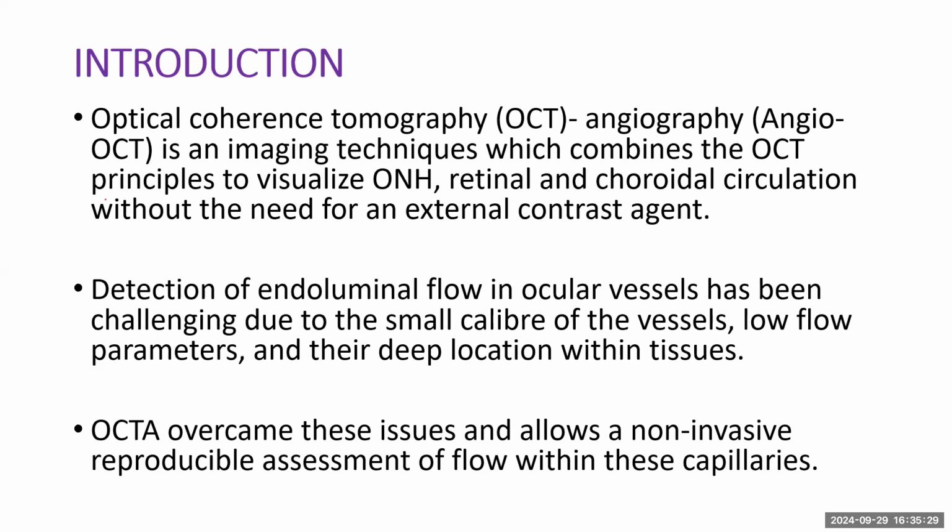But the issue with those is that the Doppler and dye systems majorly capture flow in larger vessels, while the vascular supply of the optic nerve head and retinal nerve fiber layer is tissue capillaries. They could measure the ophthalmic artery and vein, but when it gets down to the tissues and capillaries, it becomes an issue. And this is where OCTA came into place.